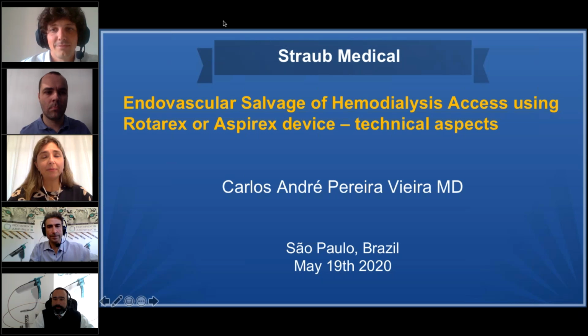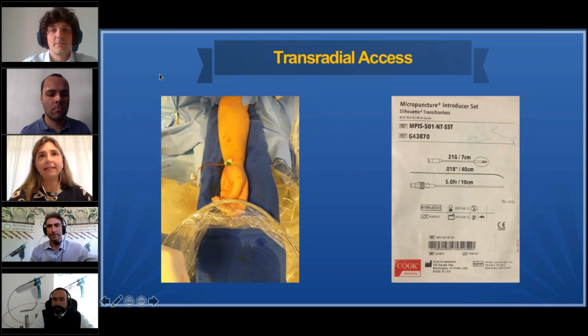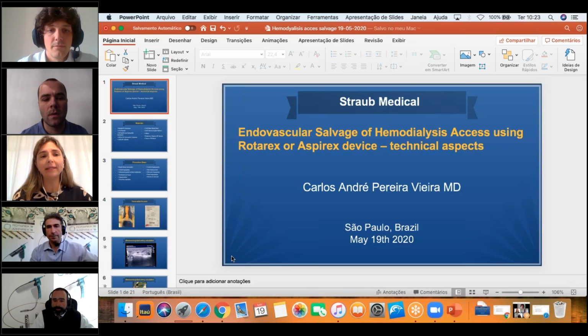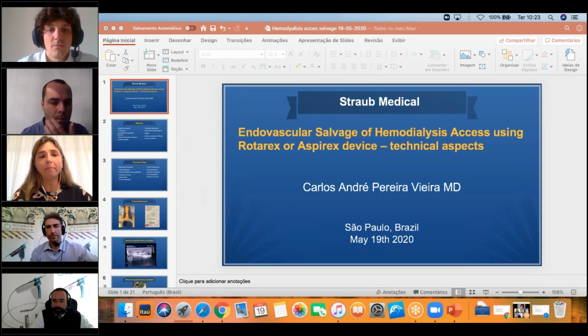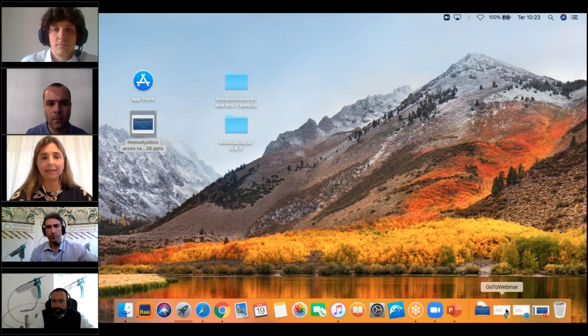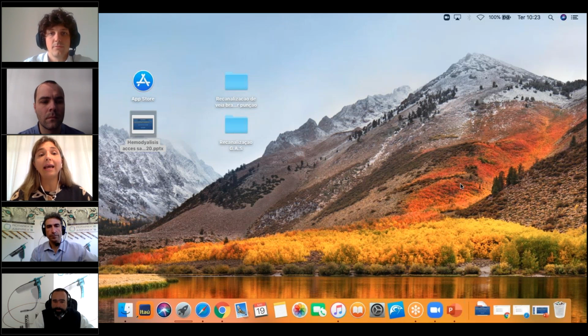Yes, in my experience, when I treat occluded AV native fistula grafts, I usually have a very short segment of occlusion, usually a 10 to 20 centimeter occlusion. Especially when I go with a double puncture, I usually don't need flushing because I'm working through a short sheath. If I go through remote access and use a long sheath, I usually go with continuous saline irrigation. But if I work with a short sheath and I have an arterial flow through the graft, even occluded, I choose not to irrigate.